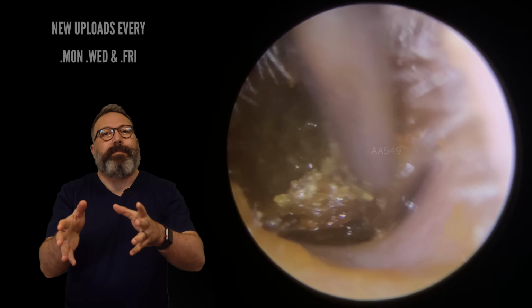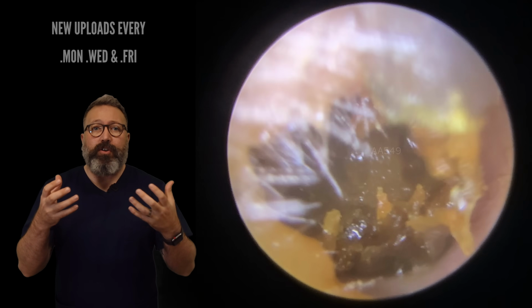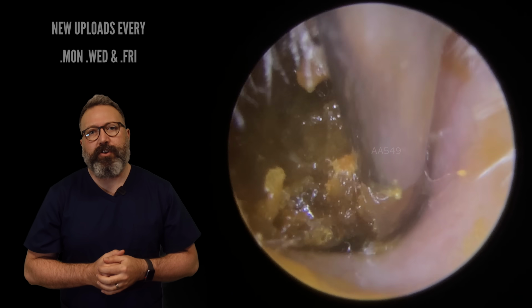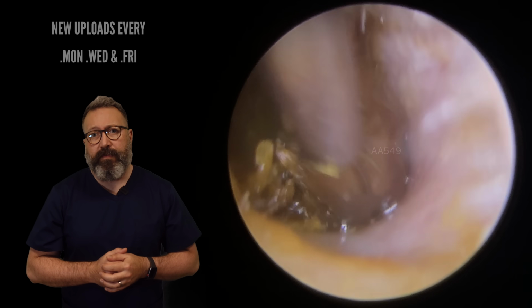Anyway, this is the patient's other ear canal. You can see here, this is tough stuff. It's a good old chunky plug, this one, rather than that kind of soft, sticky stuff we were just removing from the other ear canal. So we've got a good grip here. I'm trying to coax this down the ear canal and folding it over from the side.